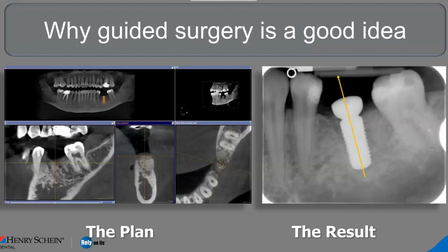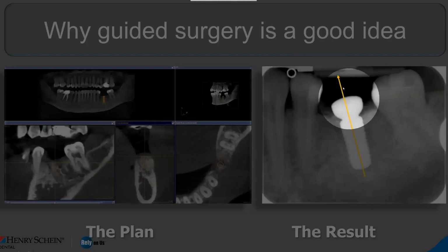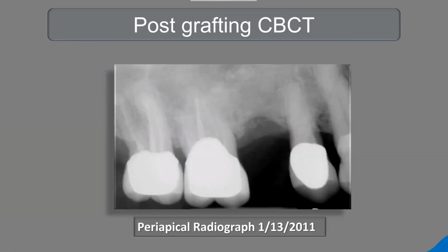Guided surgery takes a lot of that guesswork out, because we know that just because you have a huge area in which to plan your implant, you can't always place it the way that you want to. And so we do see this time and time again. I definitely would recommend a surgical guide.